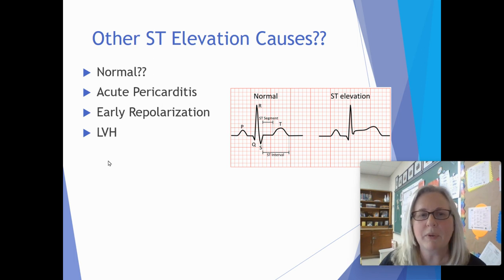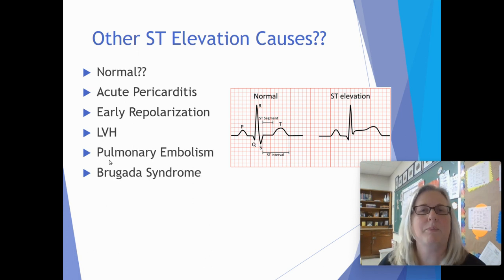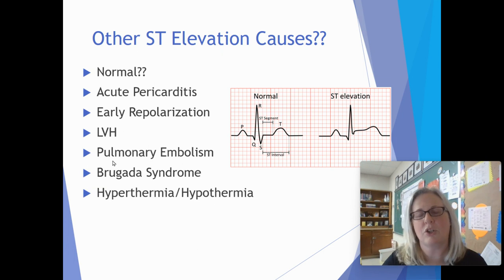Of course, there's pulmonary embolisms. There's something called Brugada syndrome. Any patients that have hyperthermia or hypothermia, and then there's trauma cases too. So all of these can cause actual ST elevation as well. So lots of things to look at. It's not always a heart attack. Okay, so let's take a look at some more of these.